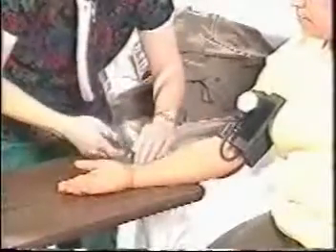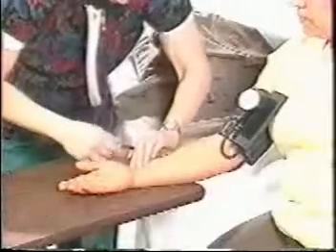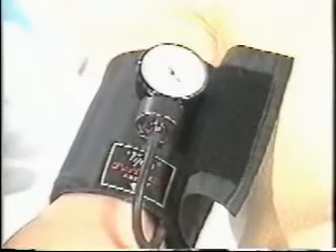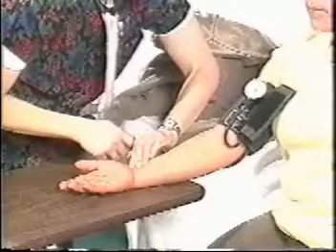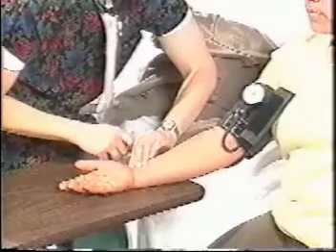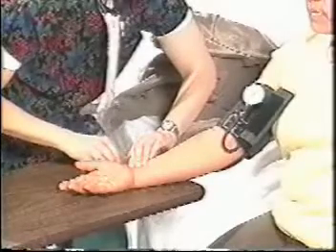Center the bladder of the cuff over the brachial artery and 1 to 1.5 inches above the elbow. Estimate the systolic pressure by placing the bulb in the dominant hand for pumping it up, feeling the radial pulse with the other hand, inflating the cuff to 90 millimeters of mercury and increasing at 10 millimeter increments until the pulse is no longer felt. This is the estimated systolic pressure. Deflate the cuff rapidly and wait 30 seconds. Keep a mental note of the systolic pressure.